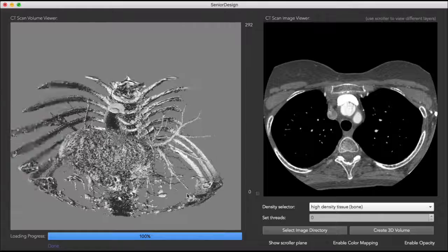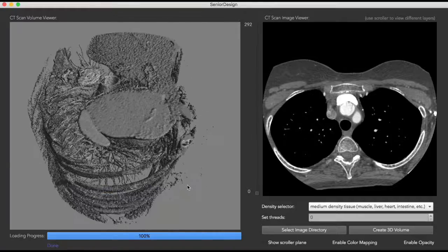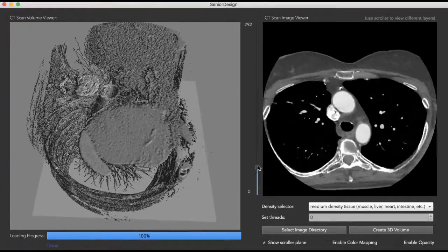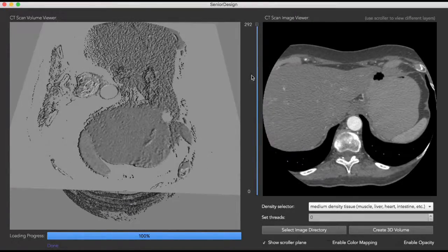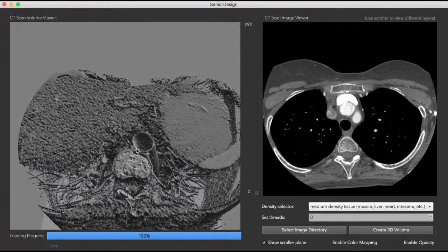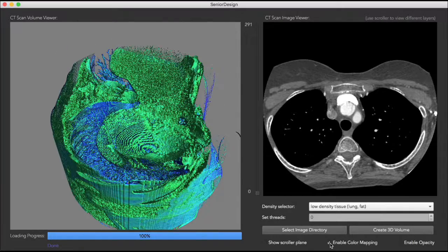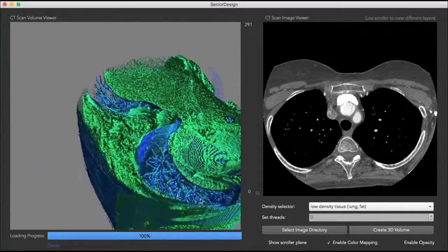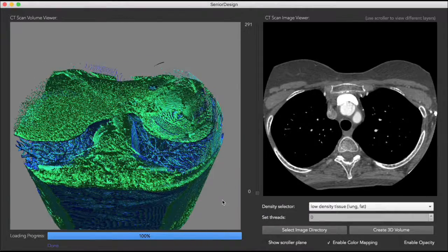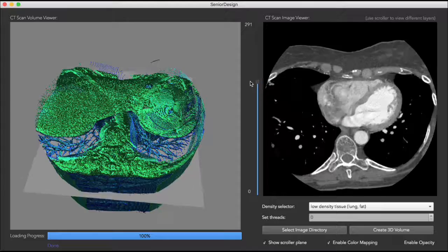You can see with the color mapping that everything's mostly yellow and red. This is the medium density. Again, you see different areas. Now you see more of the veins showing and less of the bones, although you still see some of those. And on the next one, you'll see fat. In the future, it would be nice if I could get my density selector to be smarter, but I'm very pleased with the different thresholds set for now.